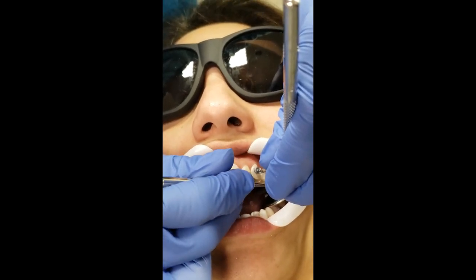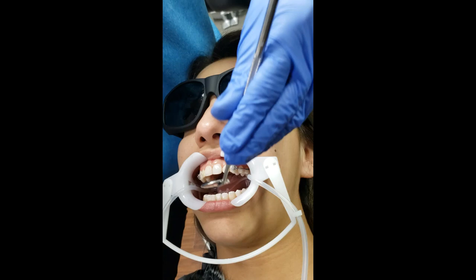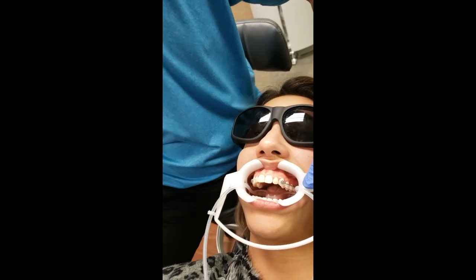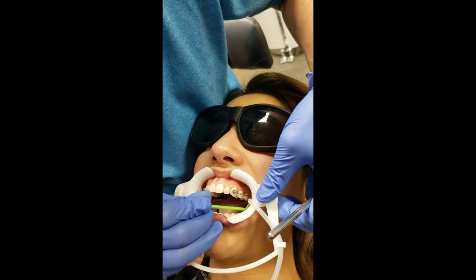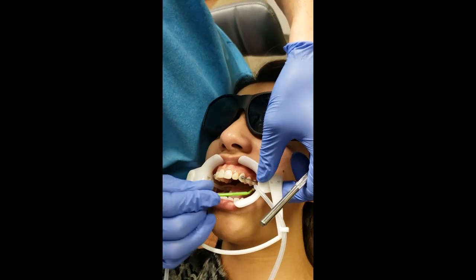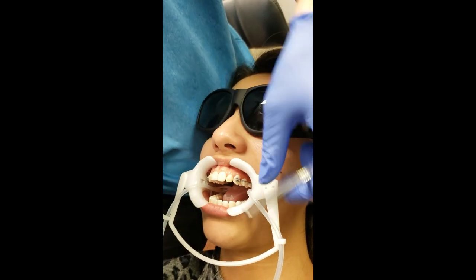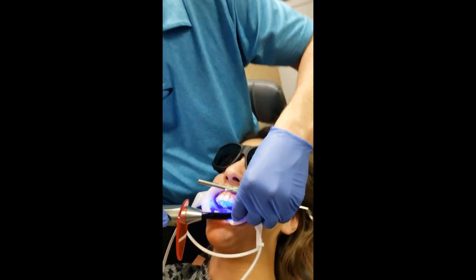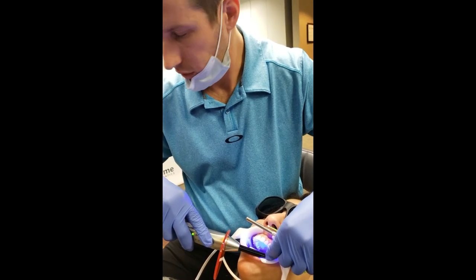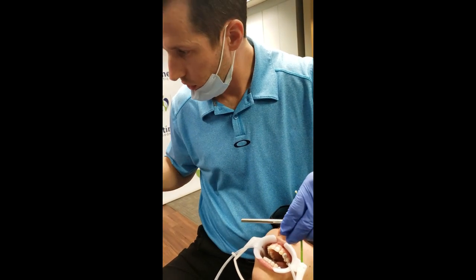If you have to favor any direction with that buccal groove and for some reason you can't get this to fit perfectly, I'd rather favor the mesial because we're trying to de-rotate that tube mesially. You can take the extra and roll it over the bracket pad here for a little bit of added retention. I'm going to cure the posterior now - the anterior looks pretty good.